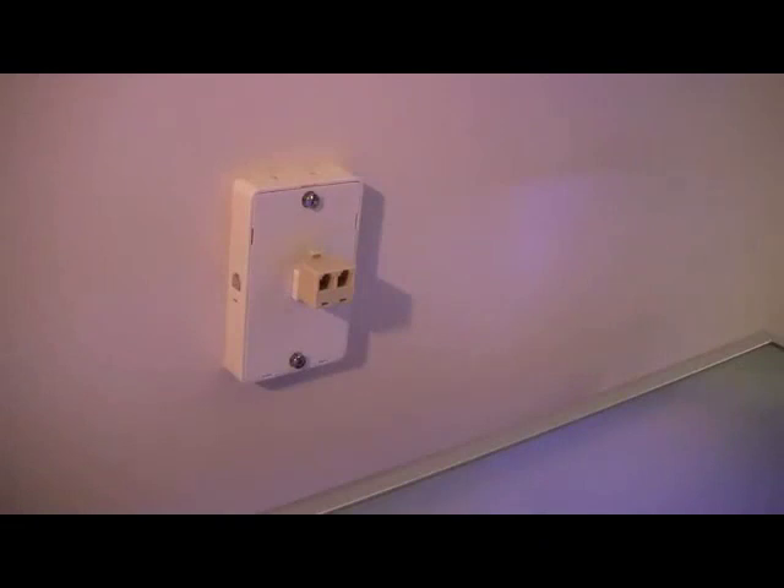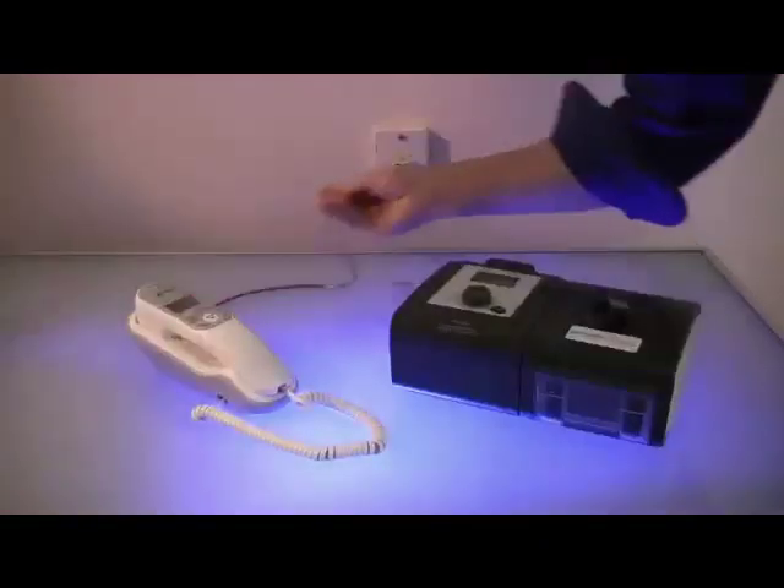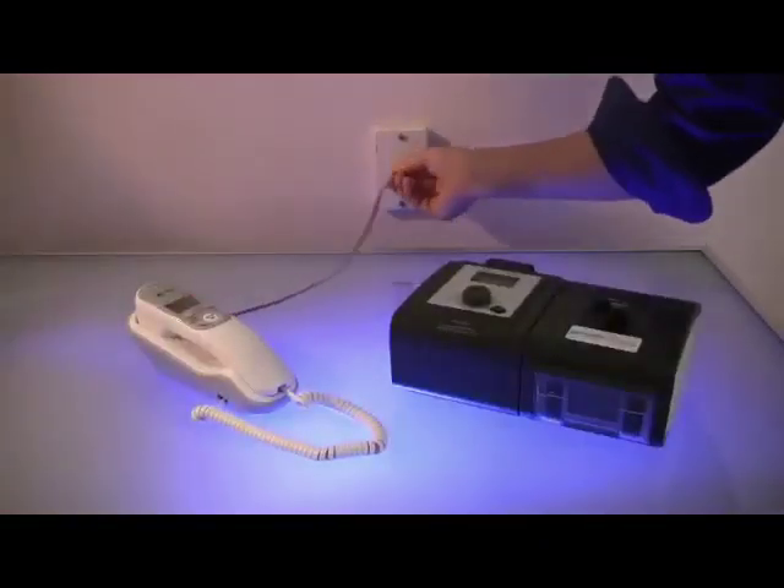Locate the phone jack in your bedroom. Take the two-line connector and plug it into the phone jack on your wall. You have now created two equal phone jacks. Plug your phone cord into one of the two phone jacks.